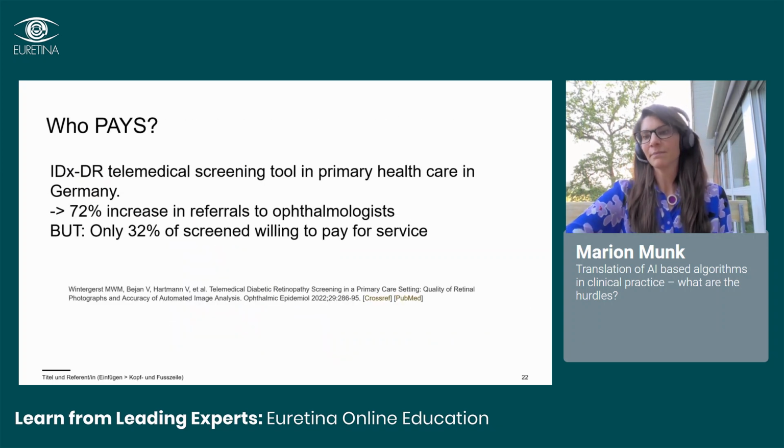A very interesting study was performed in Germany. They used the IDxDR telemedical screening tool in a primary healthcare setting. What is very interesting is that, based on the screening tool, the referrals to ophthalmologists increased by 72% in terms of diabetic retinopathy. I think this is something we have to learn, because a lot of our colleagues are afraid that the AI will take over their jobs, but rather the opposite is true. Actually, more patients are seen by ophthalmologists because of this screening.